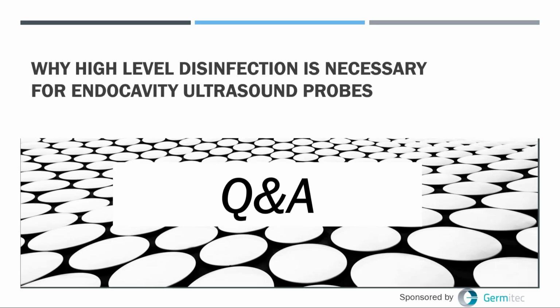Okay. The first question: if the probe cover does not tear, do I still need to disinfect the probe before the next patient? The answer to that question, it's an excellent question, is yes, for several reasons. One, multiple studies have shown that probe covers may fail, have inapparent, and I want to say that again, inapparent holes or leaks you're not aware of.